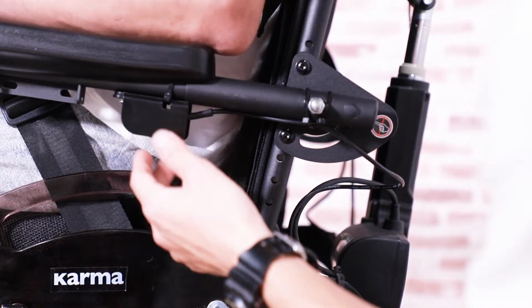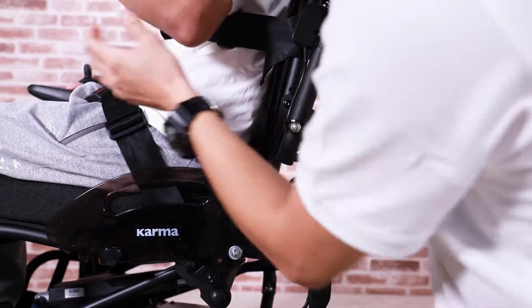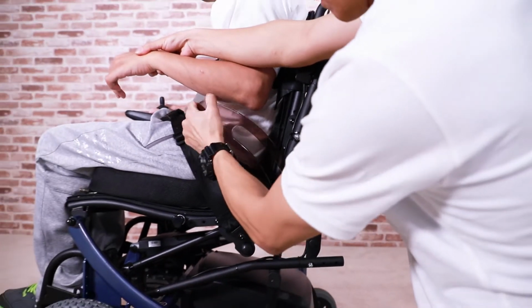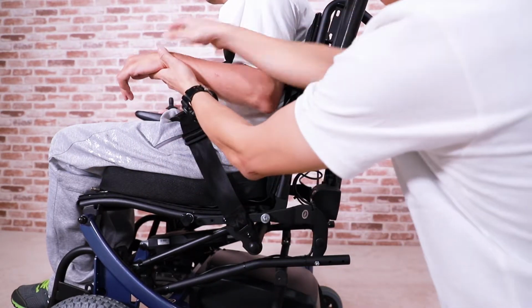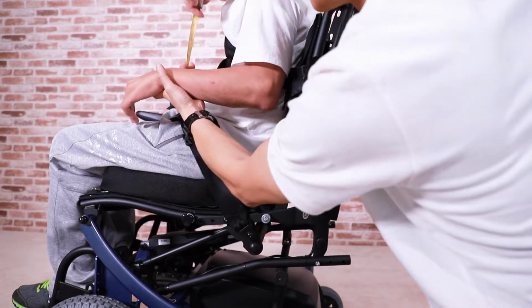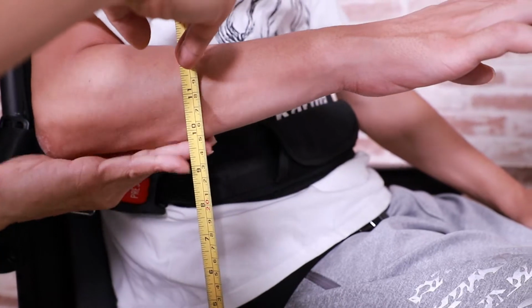Now, how do we determine the correct armrest height? Firstly, we flip back the armrest. Let the user position his arm comfortably. Measure the length between the seat frame and the arm. Help him into the position. See, it is roughly 26 centimeters.